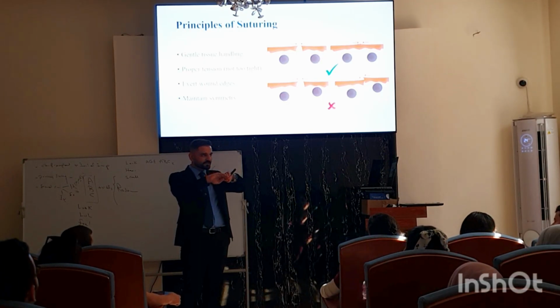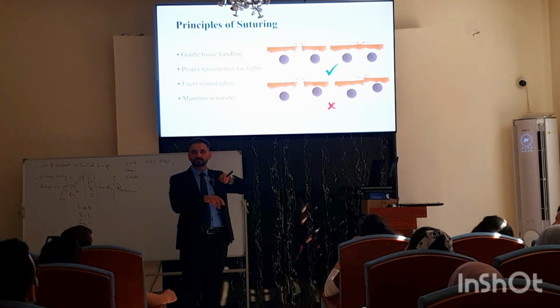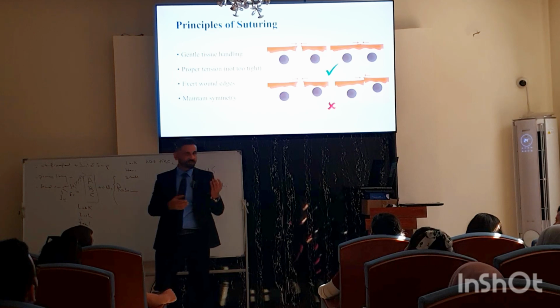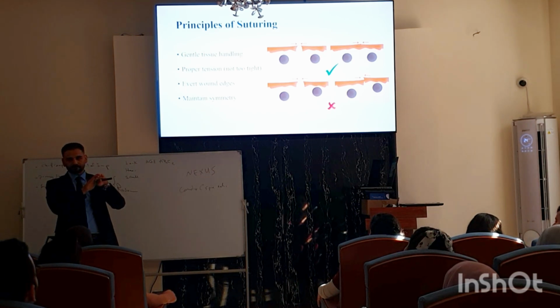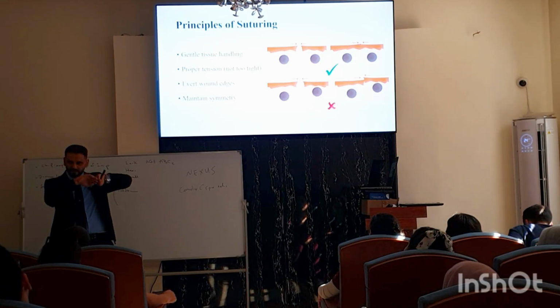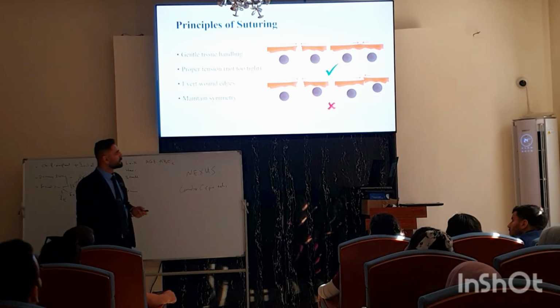But if it's inverted, it will cause the epithelial tissue along with its normal floral bacteria to go inside the body, reaching the internal dermal or even subcutaneous tissues, which are not adapted to protect against these bacteria, and will cause infection at the site. And also with healing, the ectoderm can create only an ectoderm, the mesoderm can create only a mesoderm. So when you enter the ectoderm inside the mesoderm, healing will not occur. Okay.